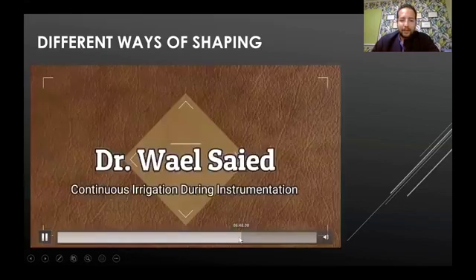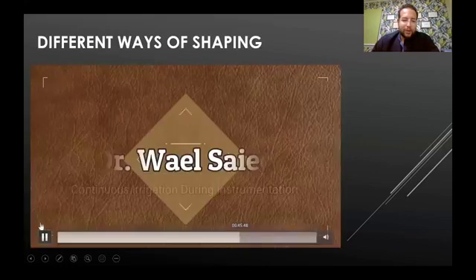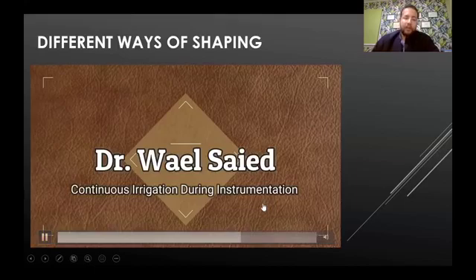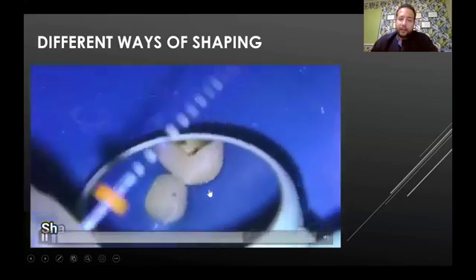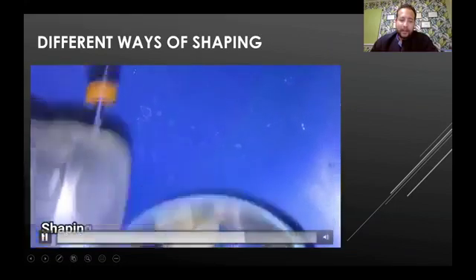Now this is my way of removing debris, called continuous irrigation during instrumentation. Okay, that's using a device I developed called SafeClean. Basically, in this method, I use a part of the system called the master head. This master head.